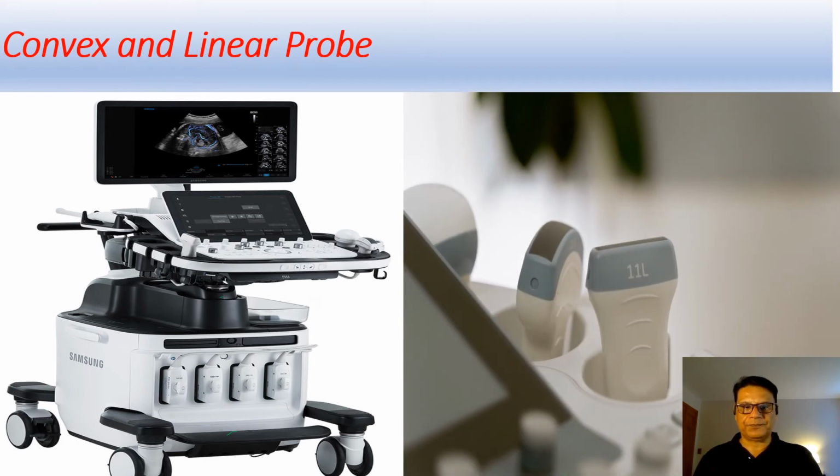So you see the footprint. This is called footprint of a transducer or ultrasound probe, and it is in the form of a line footprint. But in case of convex, it's like a curve shape. So these two transducers are linear and convex, and here are their connectors.